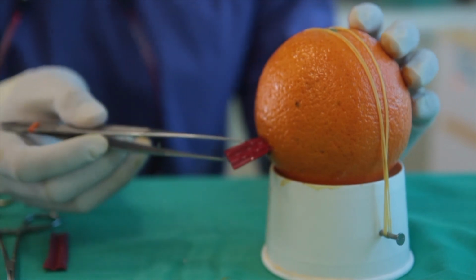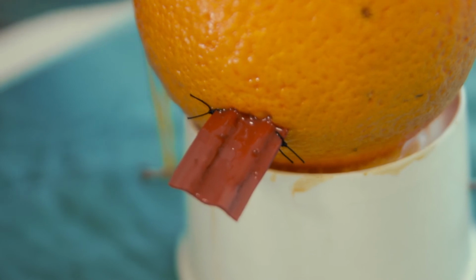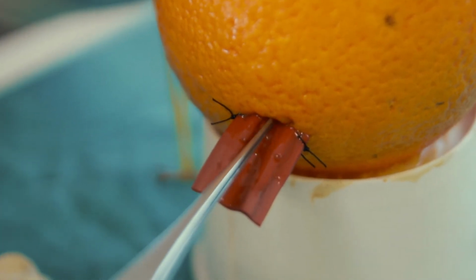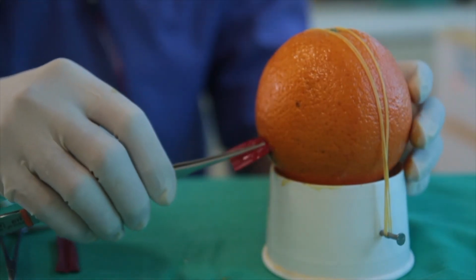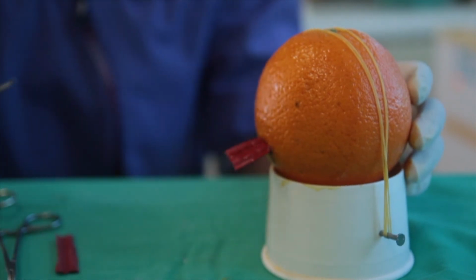And now the rubber drain is secured. This will allow the remaining pus to pass through this opening. You can do more flushing using normal saline through this opening to flush all the pus out.